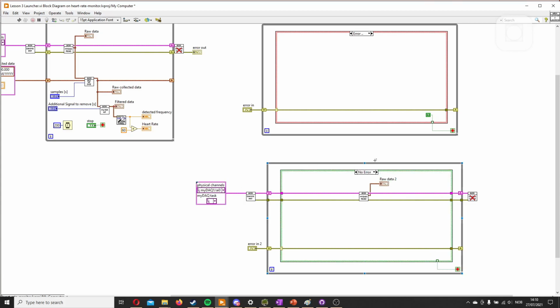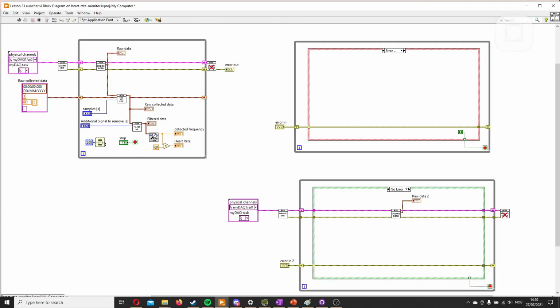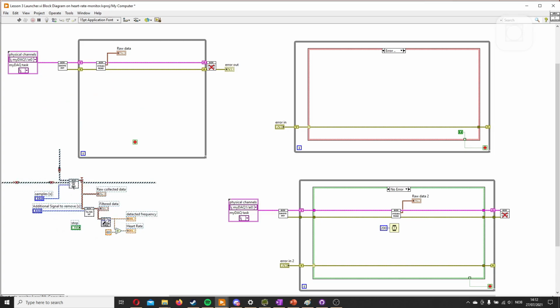So now we have dragged this one out of there and put it in its own loop. But still, there's no way to communicate it up. But before we set up that, let's just copy this part out. We also need to remember to take the timing in here. And then we will copy this too. But to avoid that we get a 2 after every indicator and control, we cut it rather than copy it. So hold Control, then press X, and then Control V.